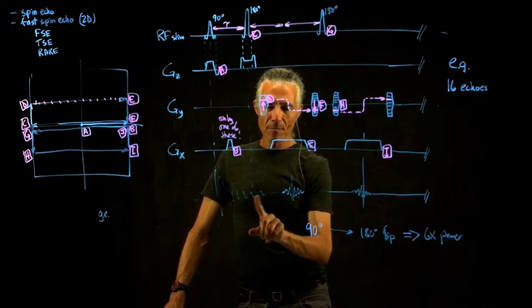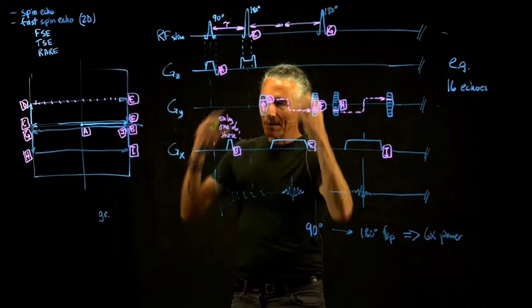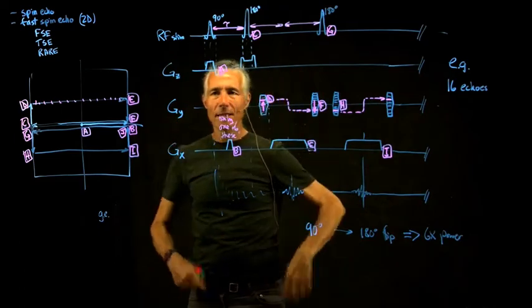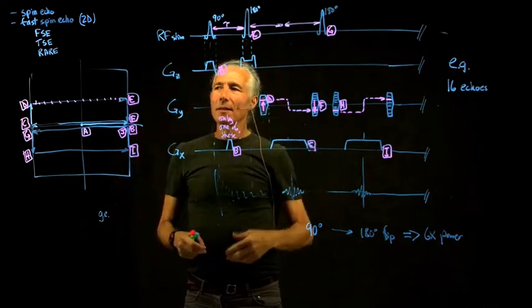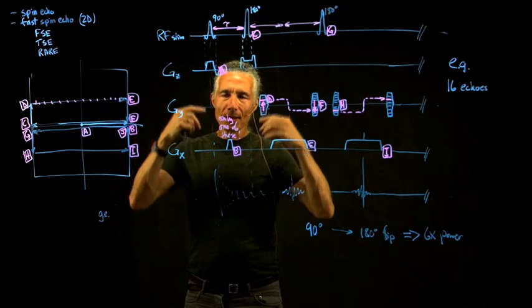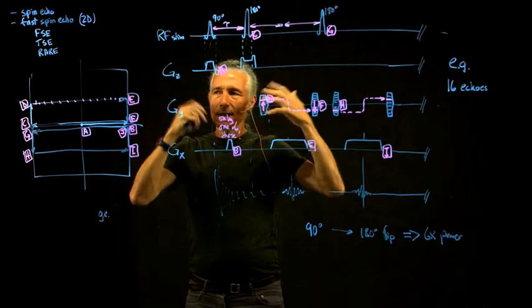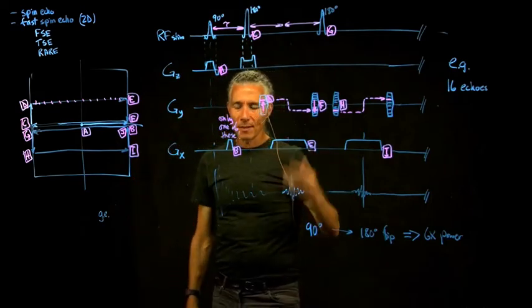And so the scanner carefully measures that, and makes quite a good prediction about how fast that heat is going to be dissipated. Because in something like the brain, a small amount of heat is dissipated very quickly because there's tons of blood flowing through the brain. It's like a finger or something, so there's a lot of blood flowing through it, and if you slightly heat it, it'll immediately get rid of that heat by dissipating it to the rest of the body.